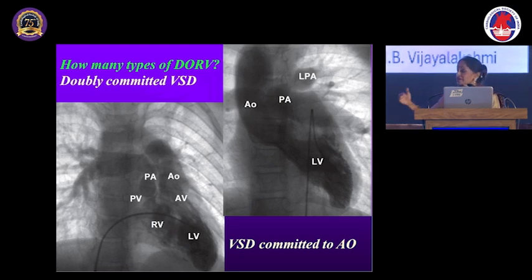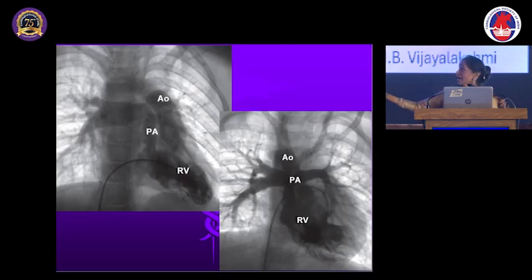And this is more risky. This is a newborn baby with pinpoint pulmonary stenosis. You can literally see that it is a pinpoint, and crossing itself is difficult, like threading a needle, and there is absolutely no flow in the lungs.